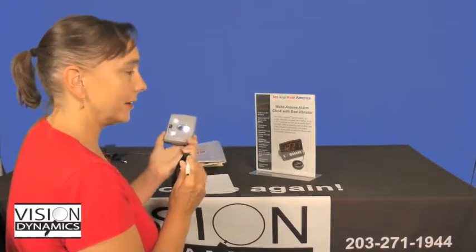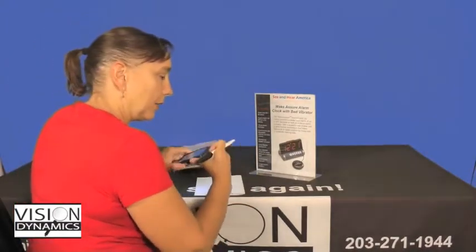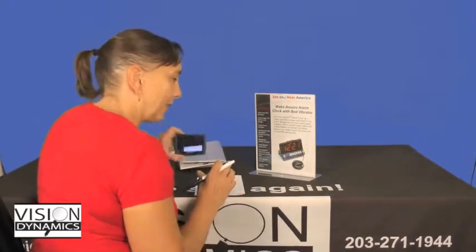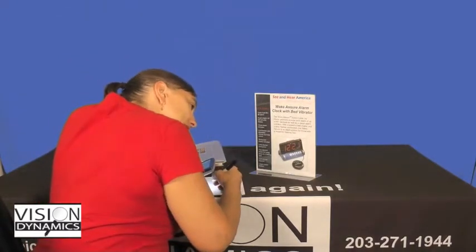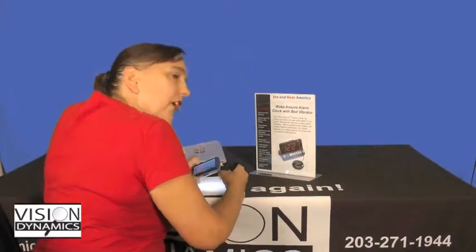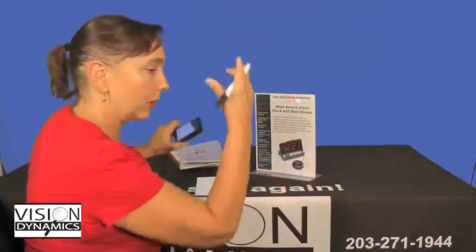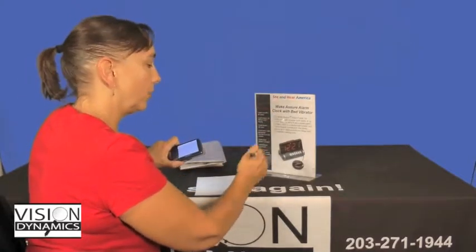But I'm right-handed, so I'm going to put it in my left hand, and I'm going to tip my Mini up a little bit. When I've got it in my hand now, I'm going to tip the right side up so I can see the tip of my pen, and I can see it well enough that I can watch myself sign. I'm not going to write my memoirs like this. I'm going to use a desktop video magnifier, one of the Optelec Clear Views, for something like that.